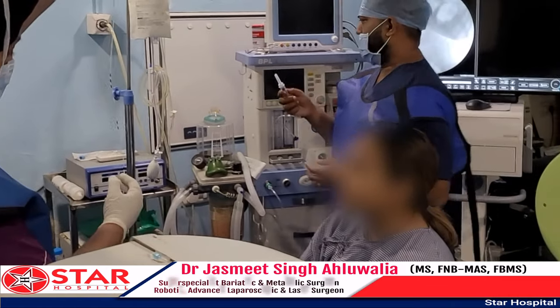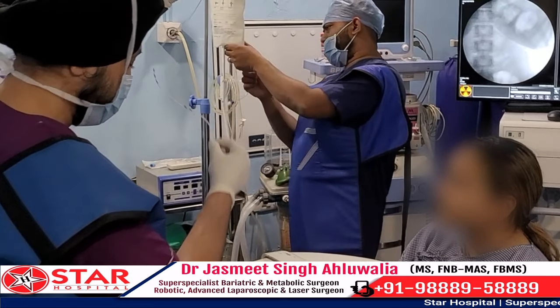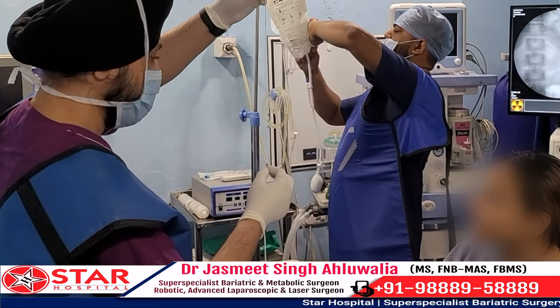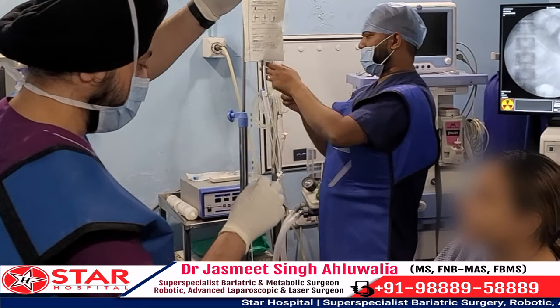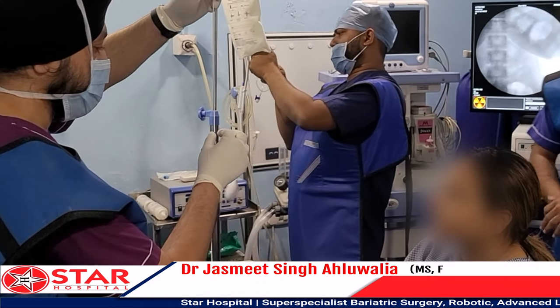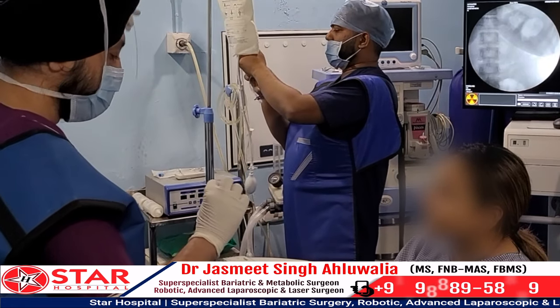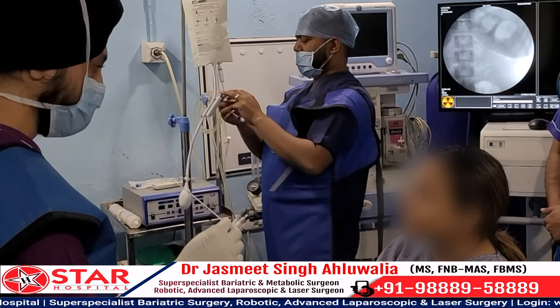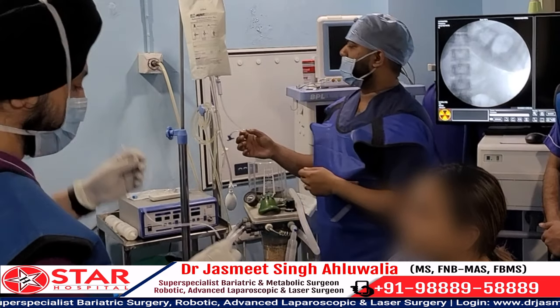This is a live video where we are going to place an Allurean balloon inside a patient. This is being shot so that patients who are thinking about getting this device placed can have a better understanding about how this device is placed and how comfortable it is to swallow this pill.